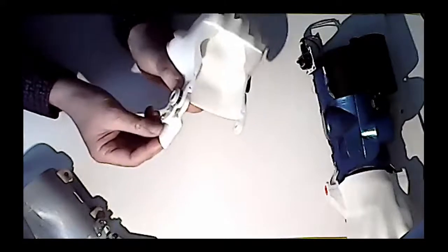Just one thing, look here, something very easy to build. I told you that we created a wrist lock. The wrist lock means that there is a wheel with teeth, and when we move the hand down, the hand stays in that position. And with the second hand, the lady will just have to remove it, and then it gets moved.